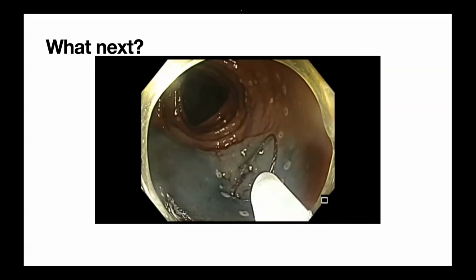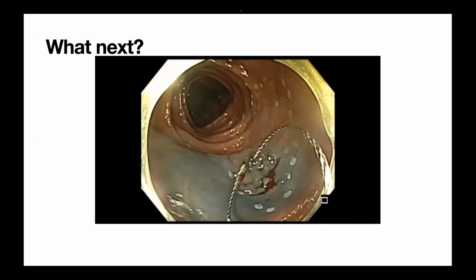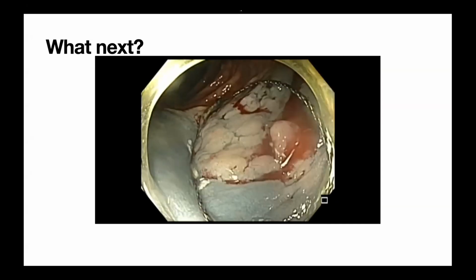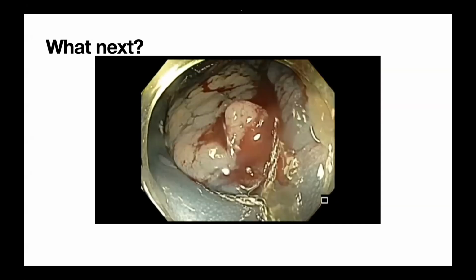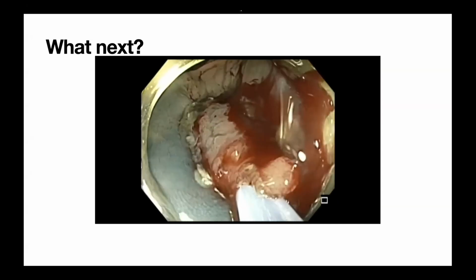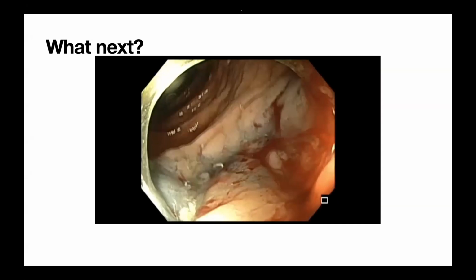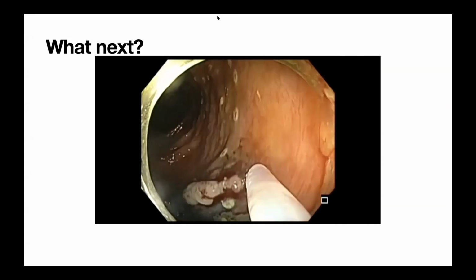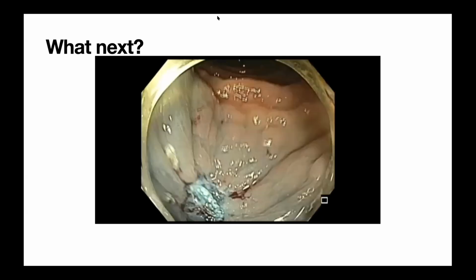They call this adenoma again. I'm not going to tell you anything. You make it even more challenging for us. This is an SSA until proven otherwise. And if somebody calls this an adenoma, I would say I need a second pathologist. I agree that endoscopically it's very likely to be an SSA.